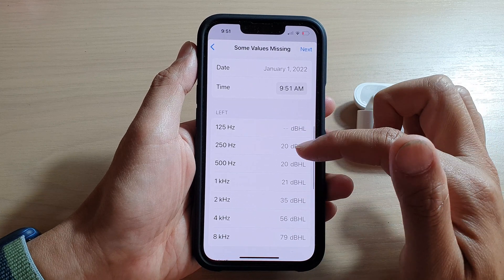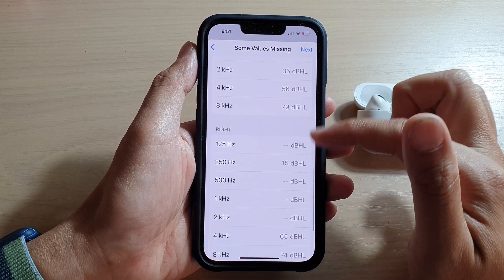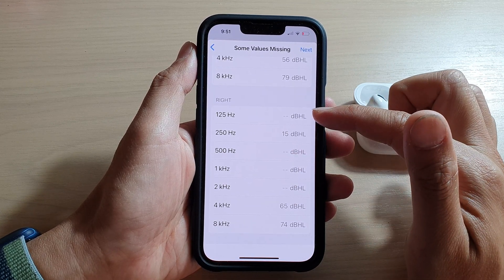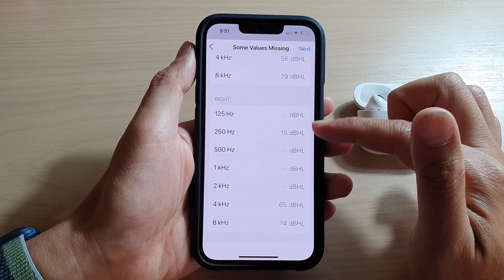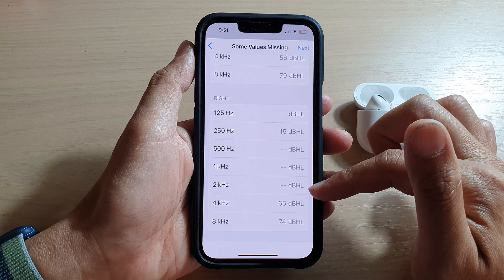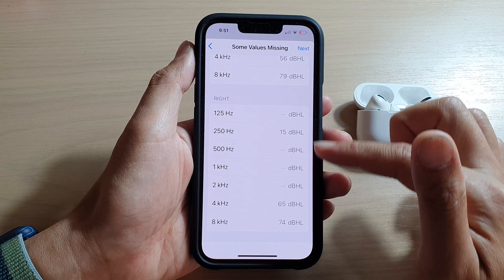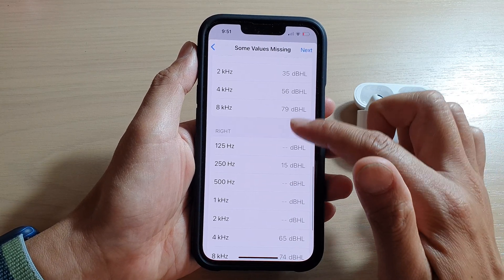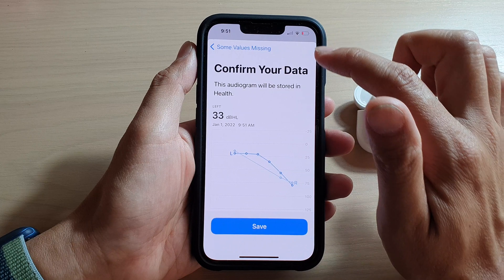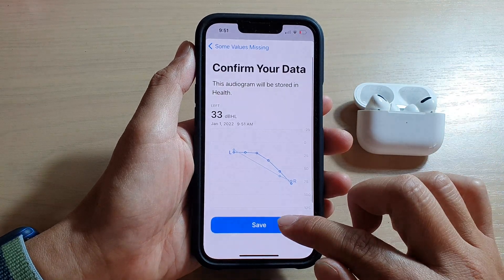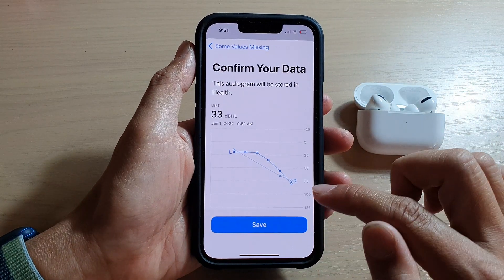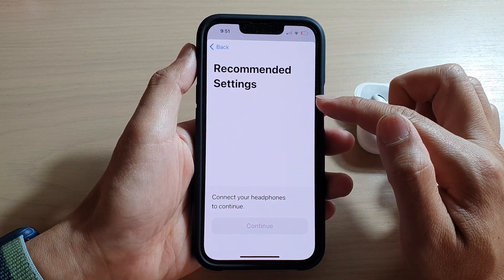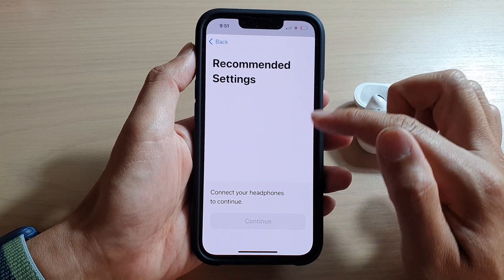You've got left and right channels. On the right channel I have some missing values that I can manually put in. After that, tap on Next and then tap on Save, and this audiogram will be saved to your Health app.